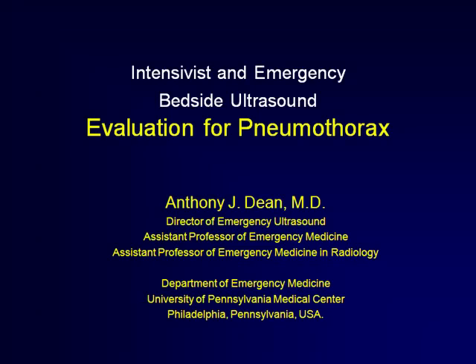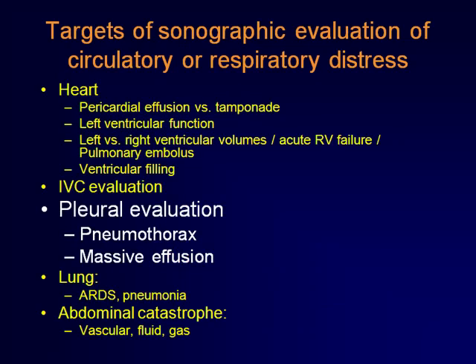So in this lecture we're going to talk about the evaluation for pneumothorax. Just to recap, overall we've been looking at the heart, the IVC, the lungs, and the pleura in the critically ill, and so in this particular hour we'll focus on the evaluation of the pleura for pneumothorax.